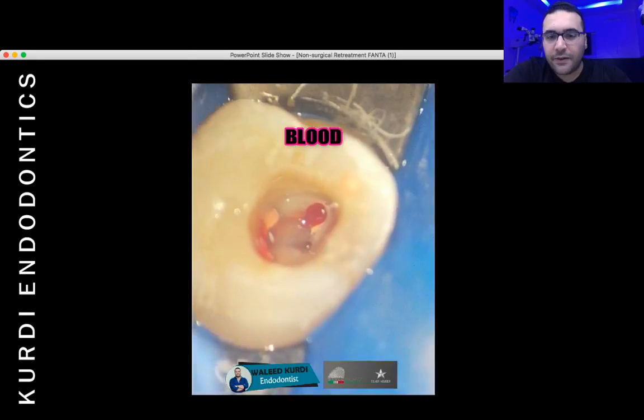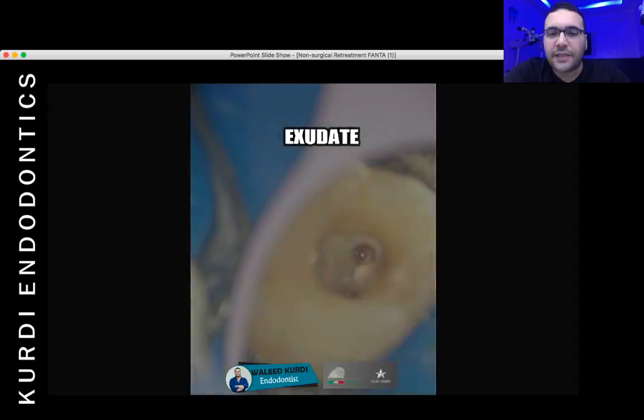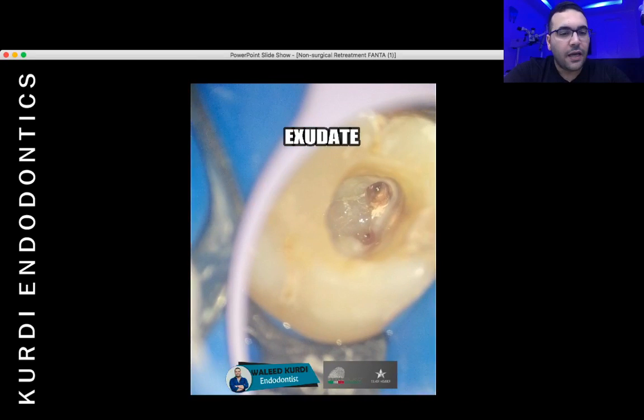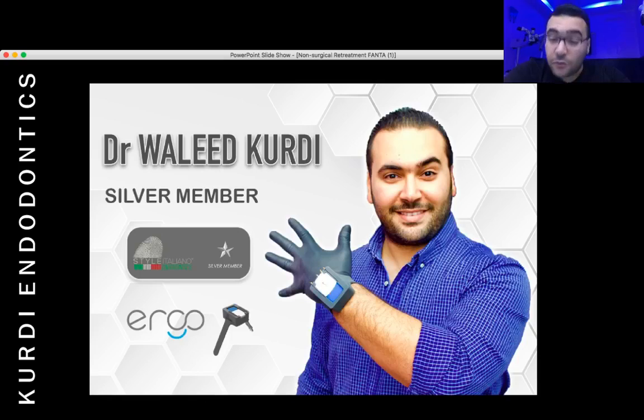And indeed, here in this case, I retreated the whole system. I retreated the distal buccal and also the palatal one. All right.